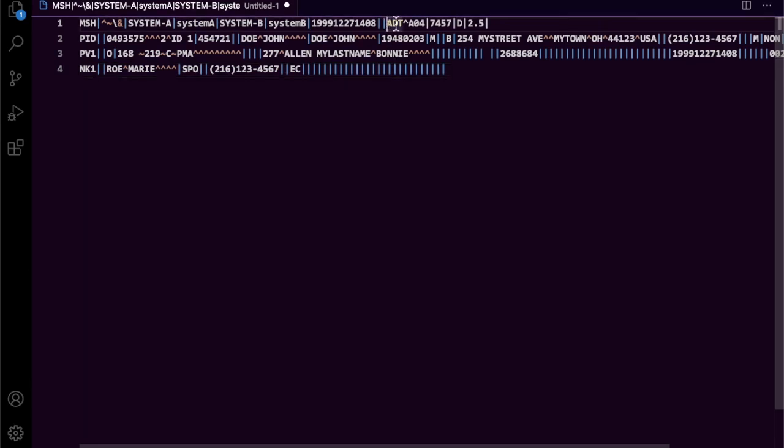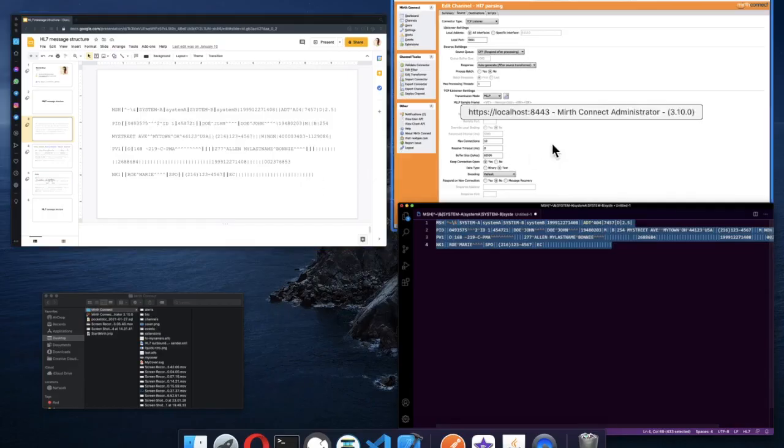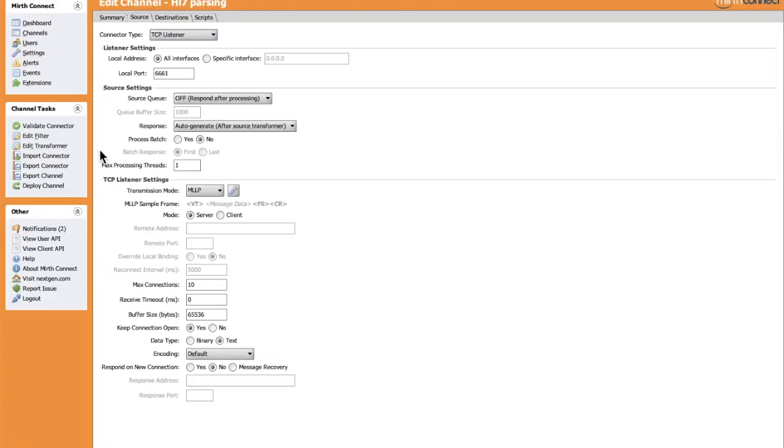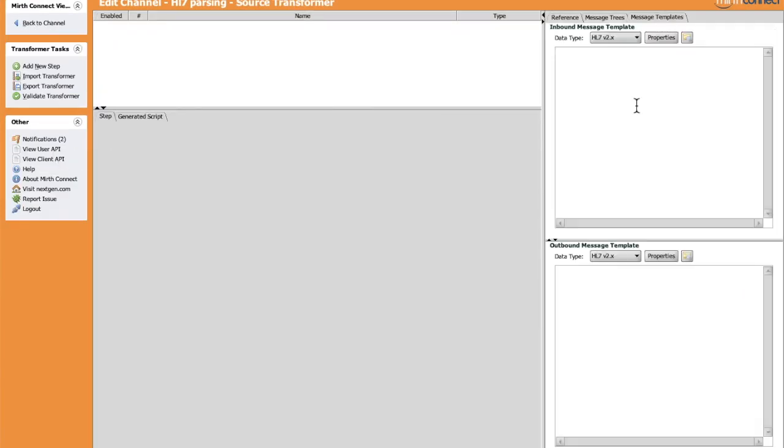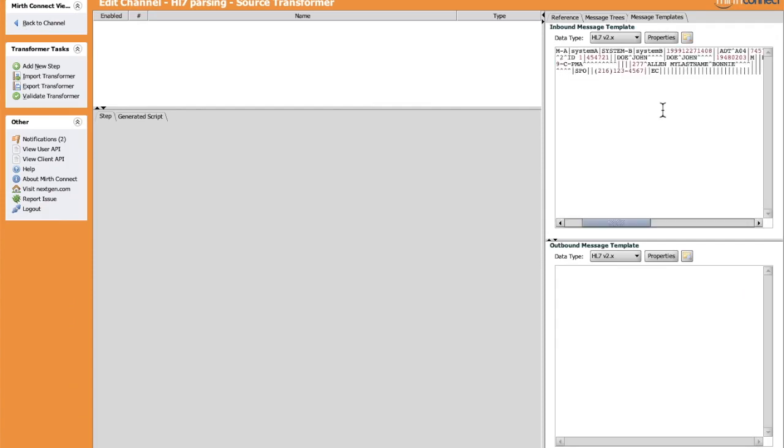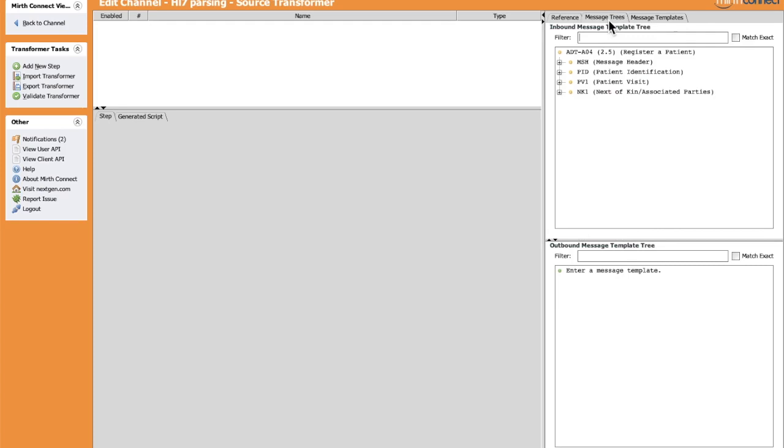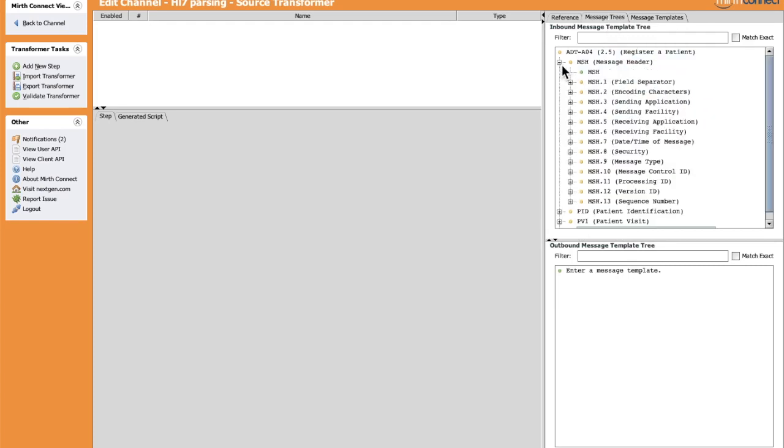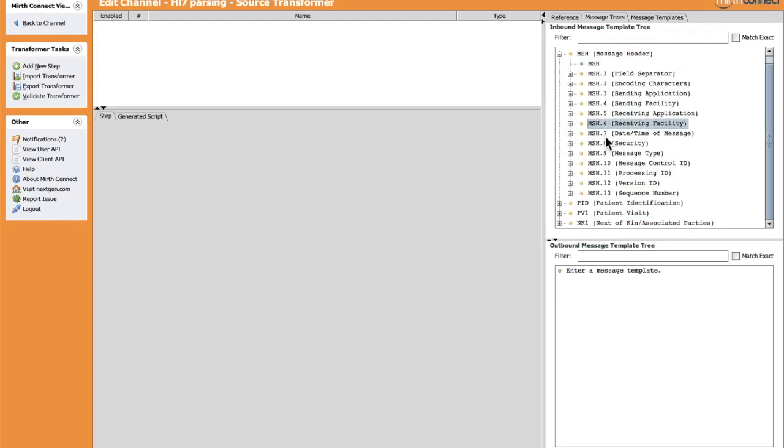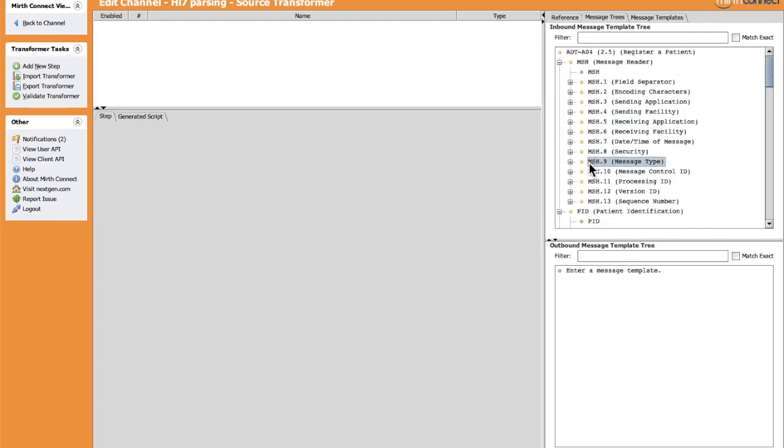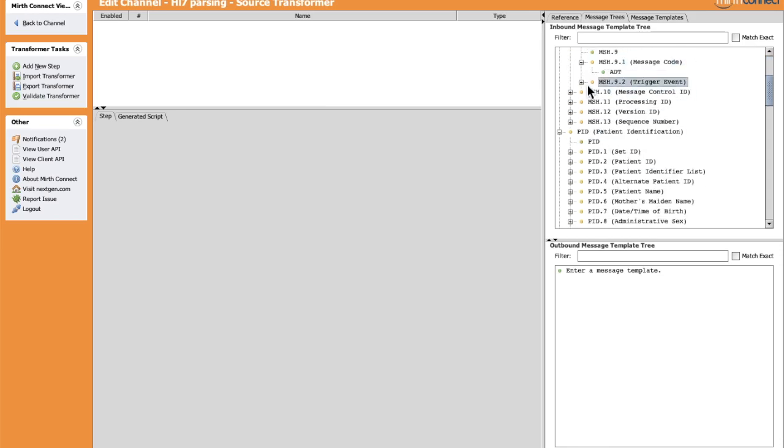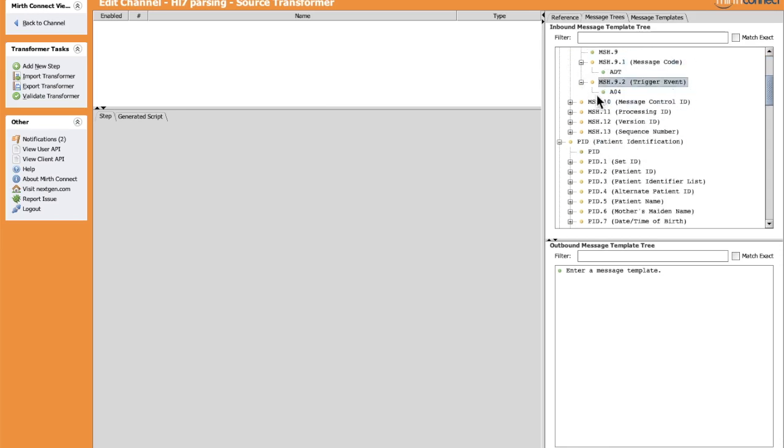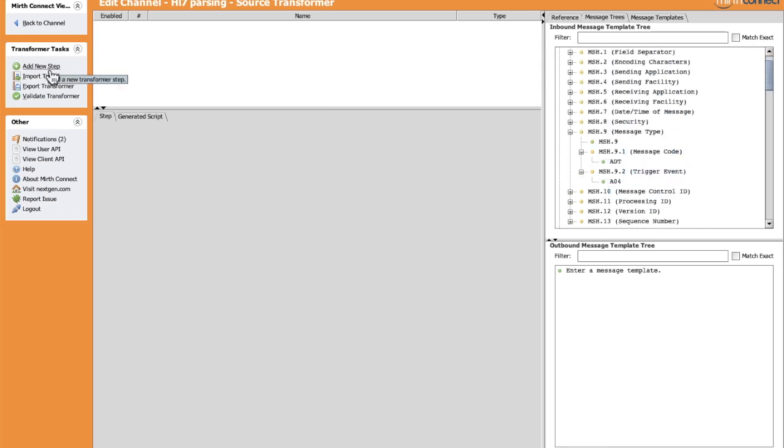Let's take this ADT A04 as an example. Let's edit the transformer. In the message template here, let's paste our template we saw before. Let's switch to Message Trees. Our message is well structured as we saw in the HL7 structure message video. The message type - MSH-9.1 is ADT, MSH-9.2 is A04. We're going to create a new step here.